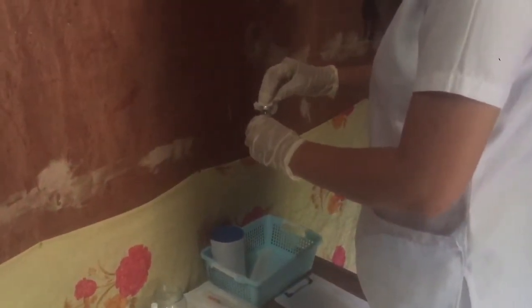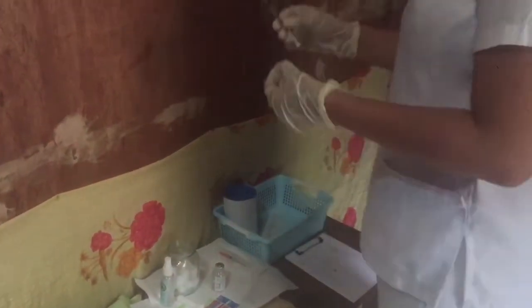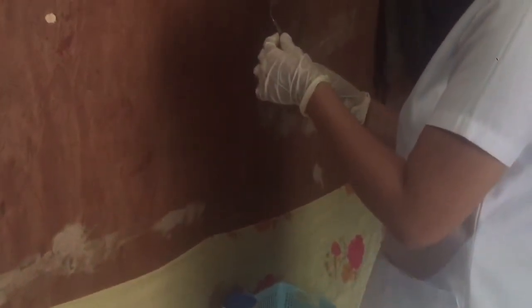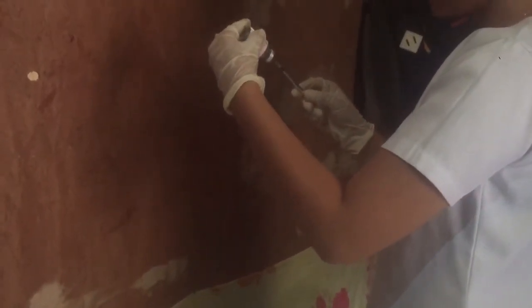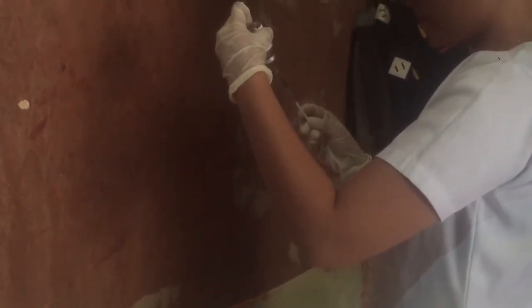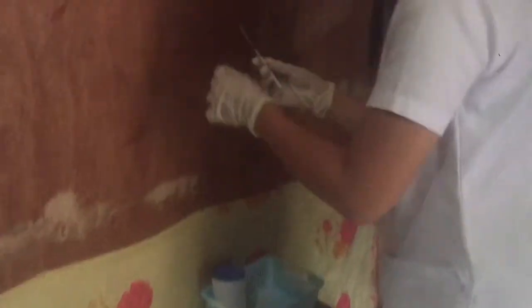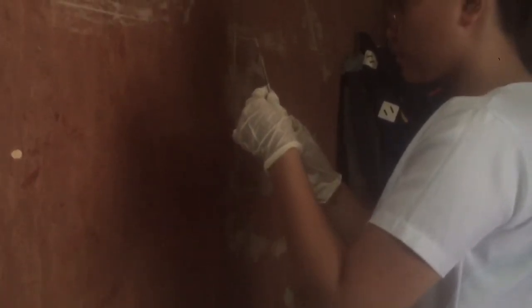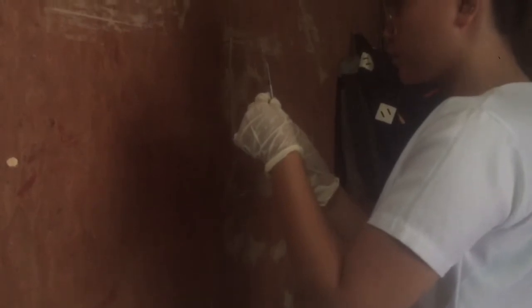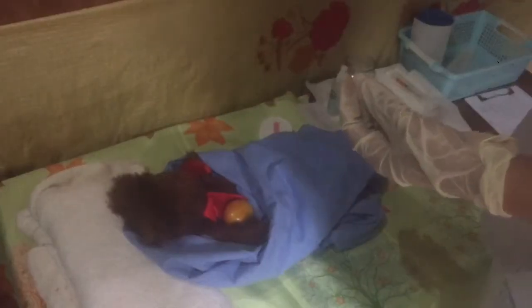Make sure to clean the vial first before getting an amount of vaccine in order not to contaminate the needle. And after that, make sure to remove the needle from the cap by pulling it off in a straight motion, and gently get a small amount of vaccine from the vial. And then check the syringe if there is air inside it, and make sure to remove it by pushing the plunger.